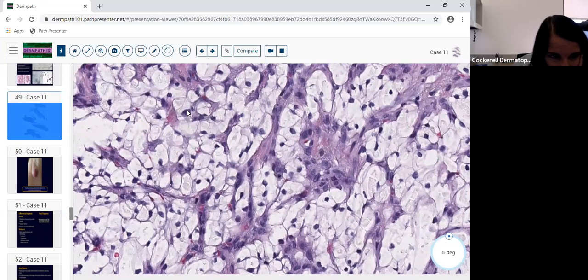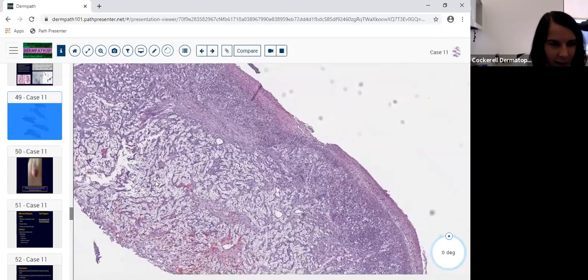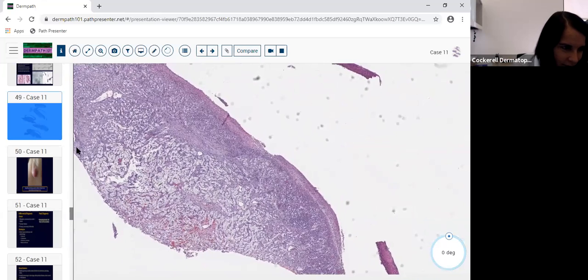These are big, angry, look at that, that nucleus is huge. And if you can't figure out if the nucleus is huge, well, look, find a red blood cell and see how much bigger that cell is than a red. It's huge next to a red, this nucleus. So even though the NC ratio isn't terribly high because there's lots of cytoplasm, you have too big. And I know a lot of you don't want to do cytology, but sometimes you have no choice. Unless you want to look at this at low power and say, hey, well, clear cells, that could be a renal cell met. So hopefully you'll get there.